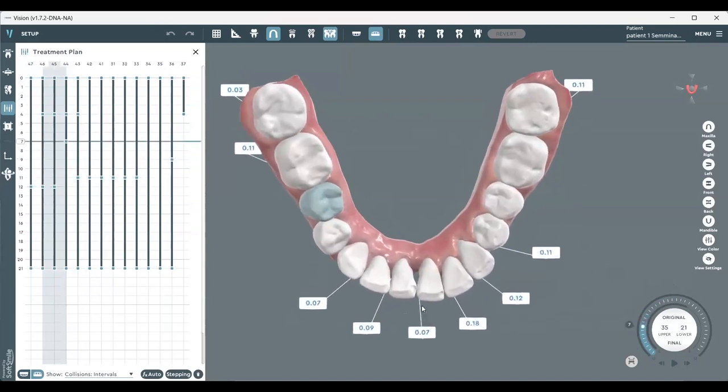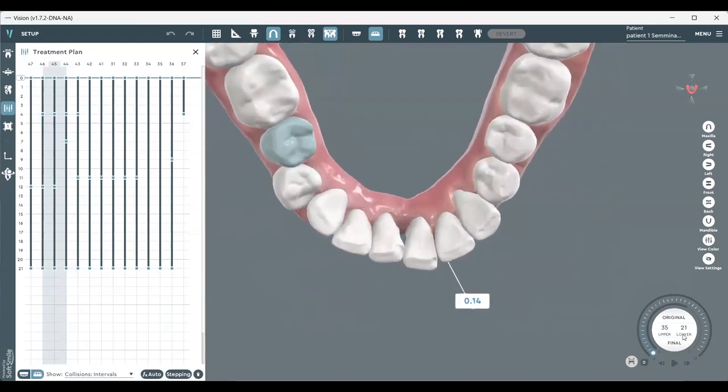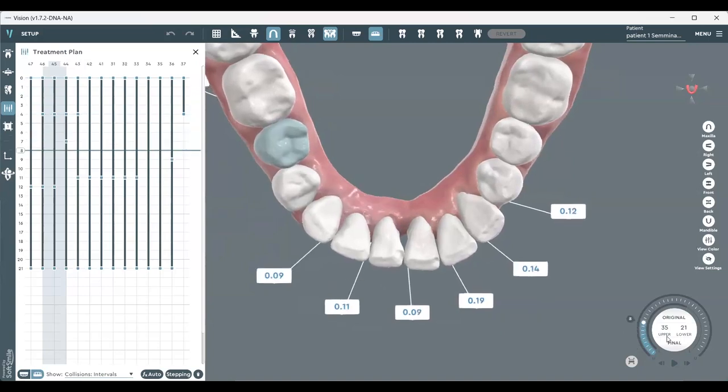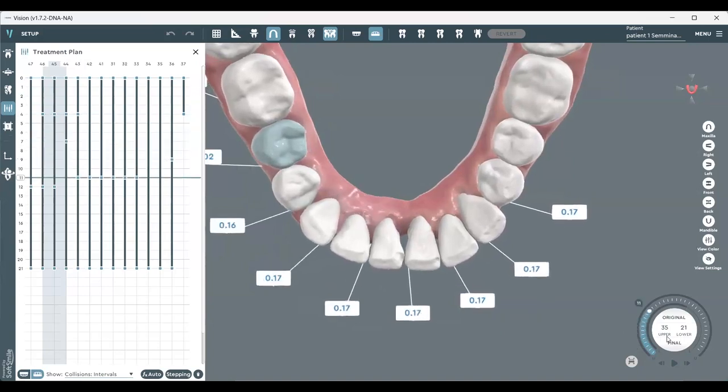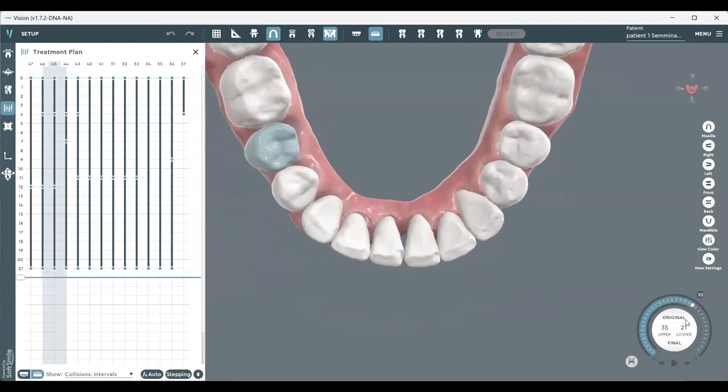And another thing that I want to show you on the lower arch is something that we call zero tolerance for crowding cases. This is going to be also shown in the next treatment plan, that is a crowding case. But I also did it here because I have crowding in these areas. And to treat the crowding, I did a zero tolerance protocol for anteriors. So I open the spaces, very careful. And then when I have a better alignment of the teeth, I retract and close the spaces.